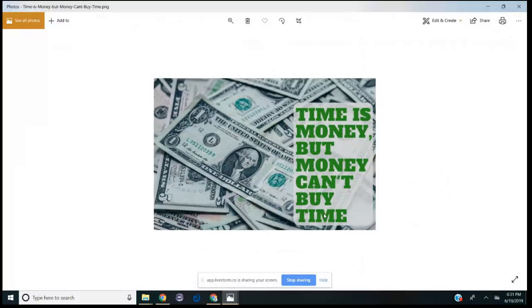Nowadays, my staff, trained really well on it, can take the Eaglet scan, go for a measurement, select a lens, put that lens on the eye, make sure there's no central touch with an OCT, and let it settle. And by the time I go into the room, I know the lens has not touched the eye, it's settling. I have all my scleral topography measurements or profilometry measurements. And really the only thing I need is an overrefraction.